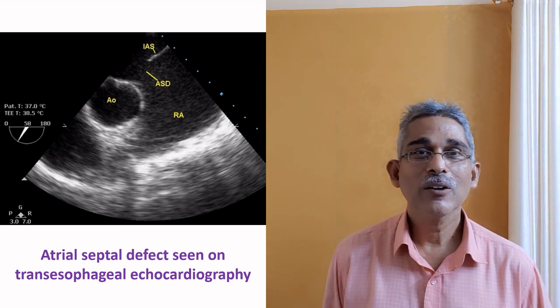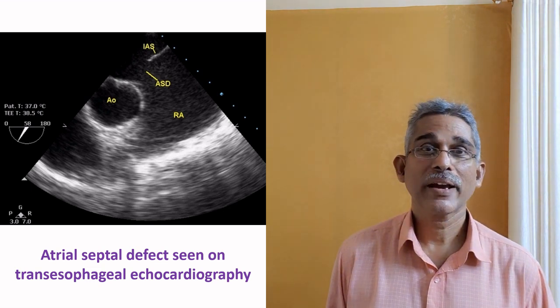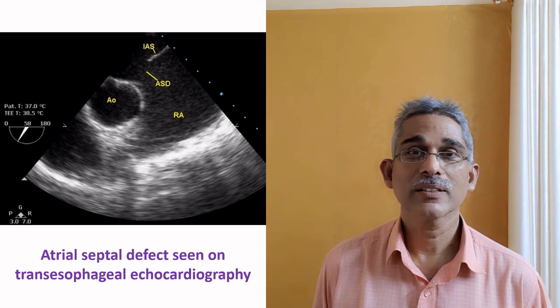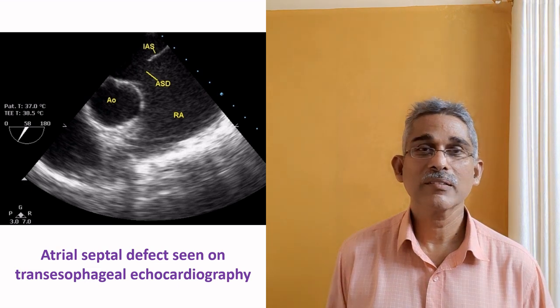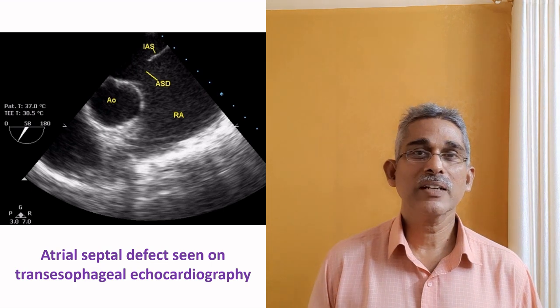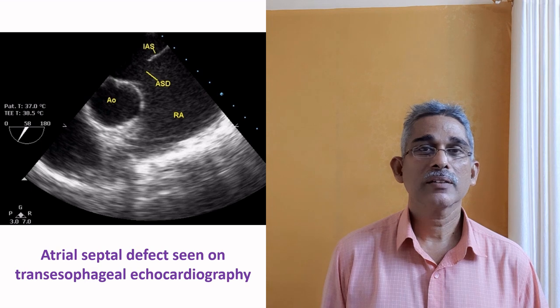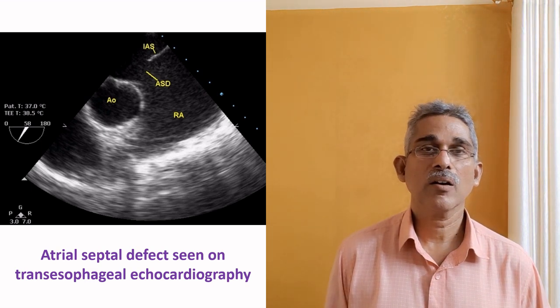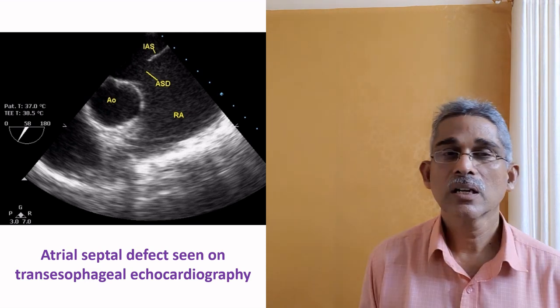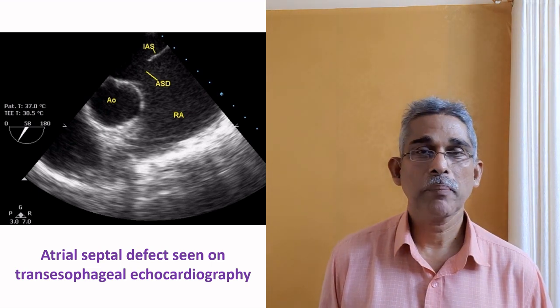You have to have some experience like an endoscopist, and a patient may gag or rather retch when it is done under conscious conditions. In the intraoperative setting, that disadvantage is not there. There are some regions which may not be imaged well by the transesophageal probe. That is where the trachea comes, the air column comes between the probe and the imaged structure, and some part of the aortic arch may not be imaged well. Otherwise, posterior structures are better imaged.